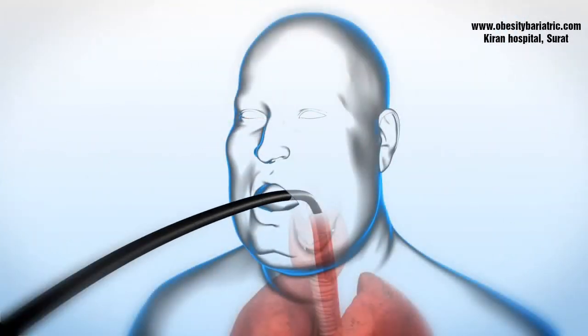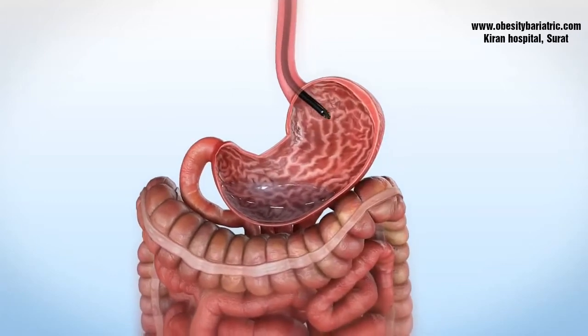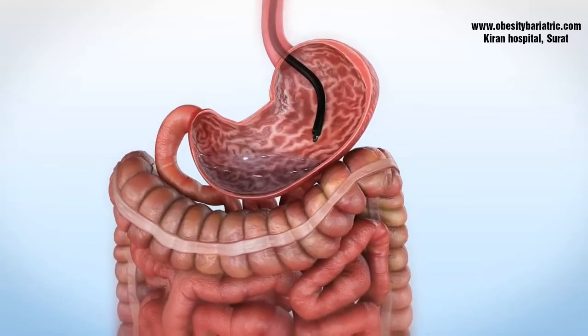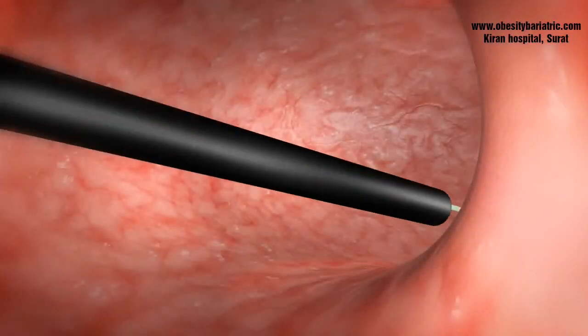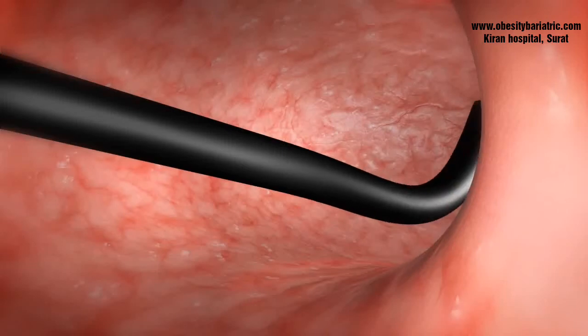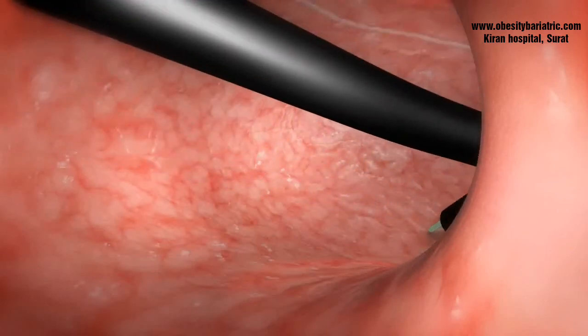Endoscopic sleeve gastroplasty is the newest endoscopic modality designed to reduce the gastric volume, thereby promoting weight loss. This animation overview provides you insight. An argon plasma beam coagulator is used to mark the anterior and the posterior gastric wall along the greater curvature.